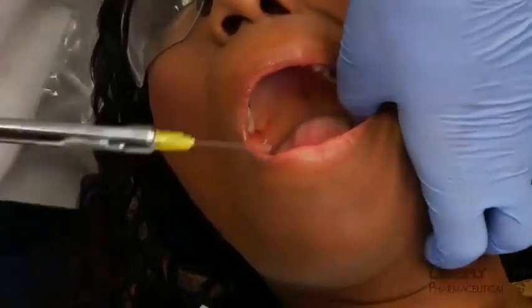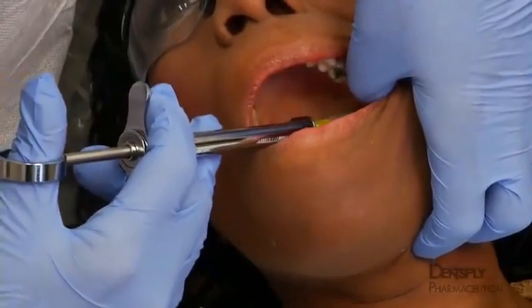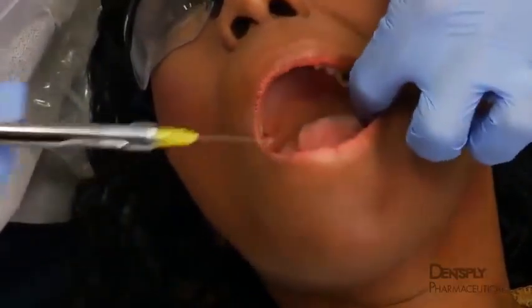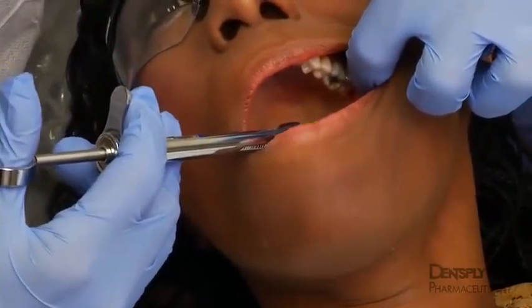The left thumb or a dental mirror is then used to expose the site of injection. Should placing the thumb in this manner prove awkward, the index finger may be used instead. Mirror images of these operator positions are used for the left-handed clinician.